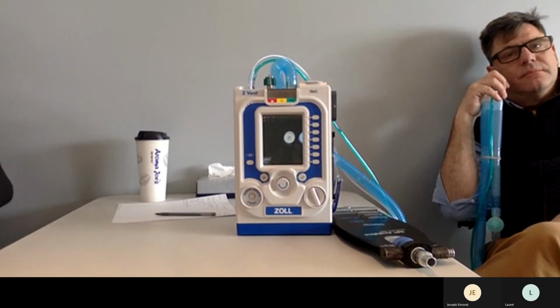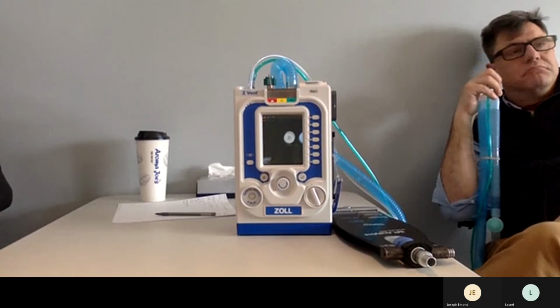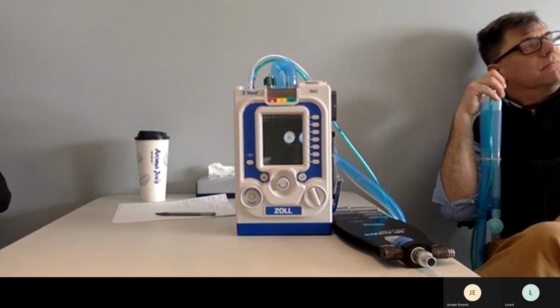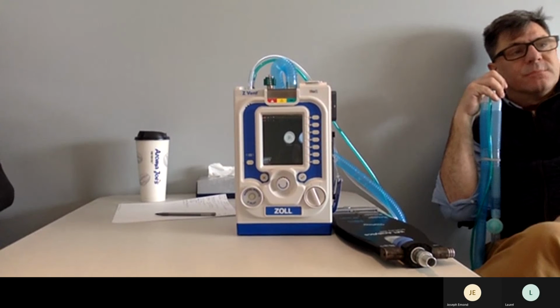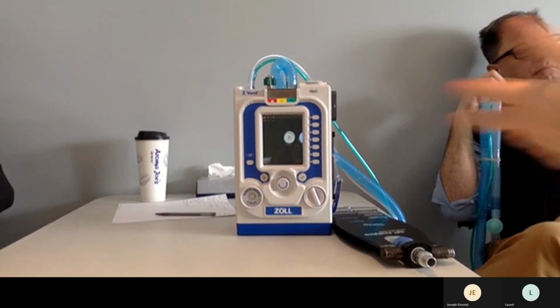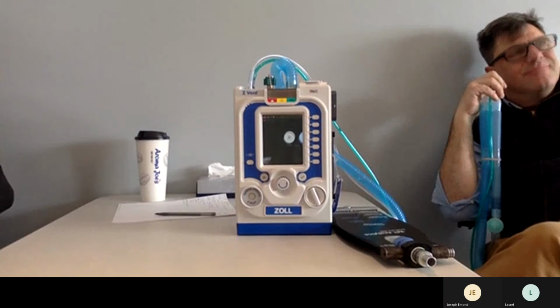The other thing we were seeing screwy was when you put them on a non-rebreather, same thing, you get screwy numbers, because it's 15 liters. And not only screwy numbers, but you won't get a good waveform. So you won't see the shark fin, right? It's getting all over.